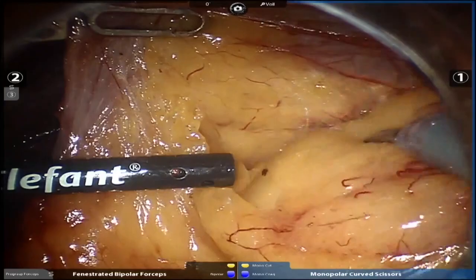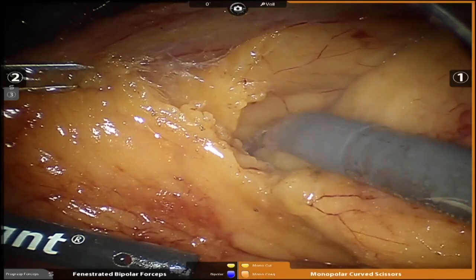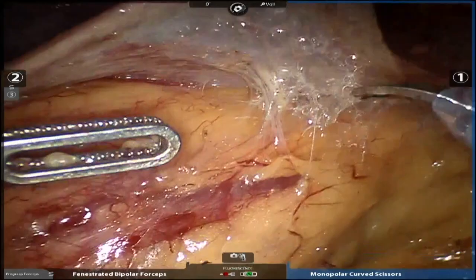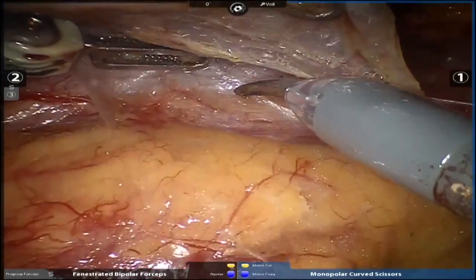And this is actually how we started using the fourth arm. When we made this inadvertent peritoneotomy, we'd use the fourth arm, and then we discovered it had other benefits. Like I said, two-handed surgery versus one-handed surgery. So we started using it routinely, and now we use the fourth arm routinely with a technique that we normally did just as a three-arm technique. As I mentioned, the downside is you need to do more dissection to get that fourth robotic arm in.